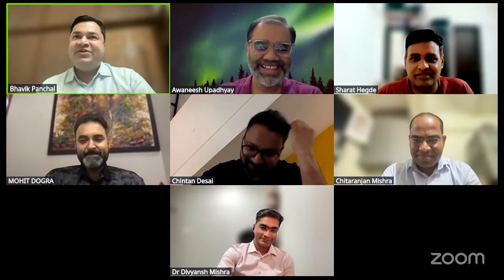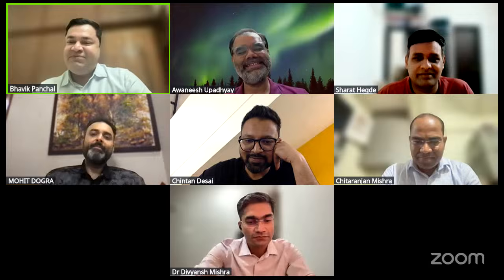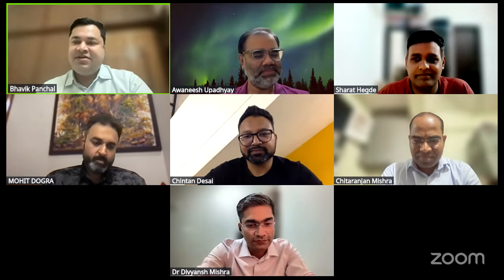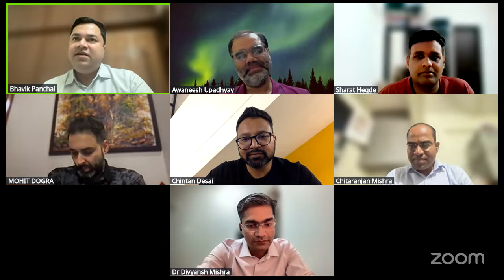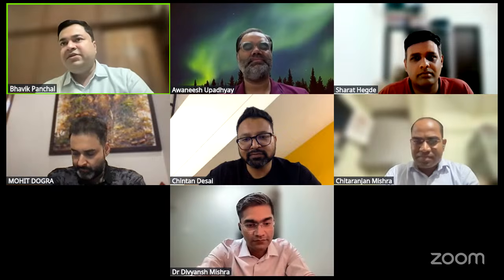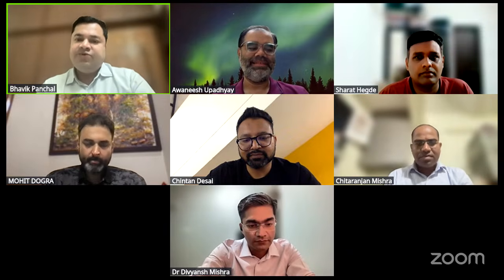To be honest, because of this moderation, my knowledge has increased so much. Now, the problem is that I'm a little confused when it comes between 600. So I call up different people and ask them, and then decide what I want to do based on the patient's OCT. And as Dr. Divyansh mentioned about the minimum linear diameter as well, yes, I agree. Less than 400, even 600 as well, conventional ILM peeling. Above 400, above 600 will go towards the flap. I'm still a little conservative towards using an adjuvant. A PFCL is the one which I would go to, as Dr. Chintan mentioned, for larger macular holes.